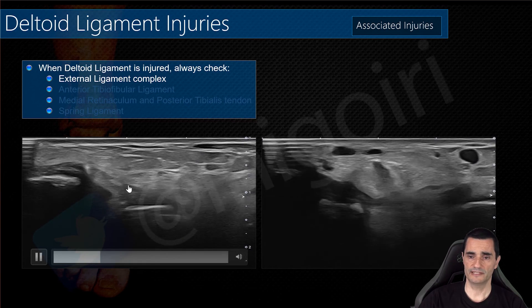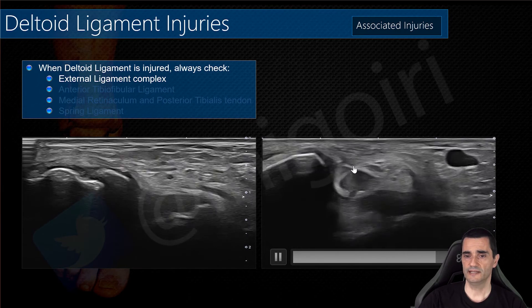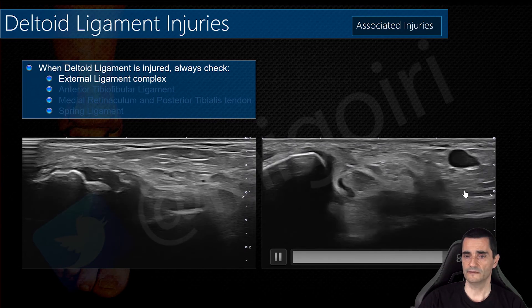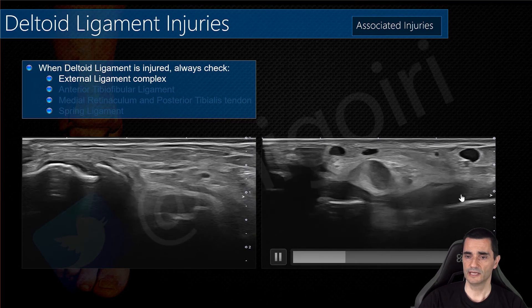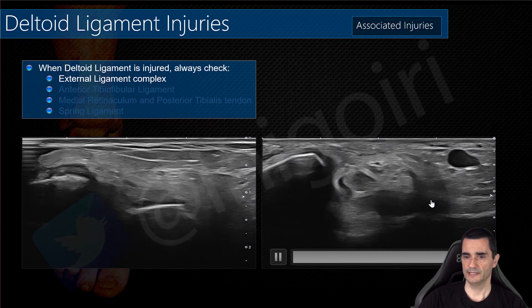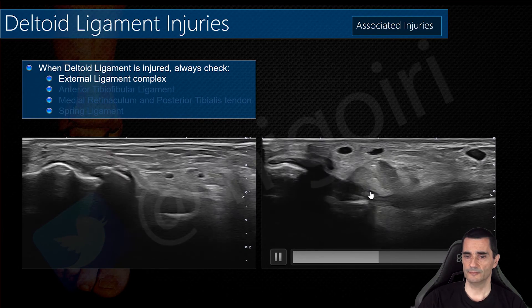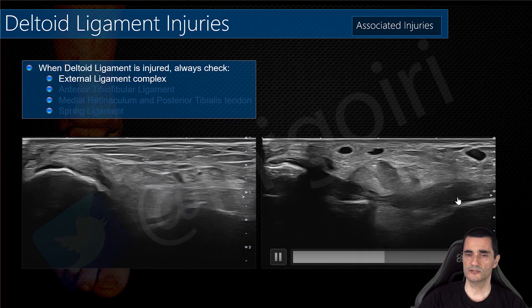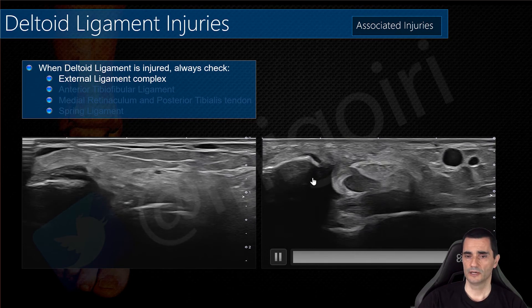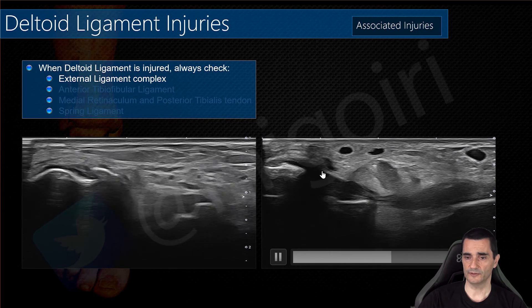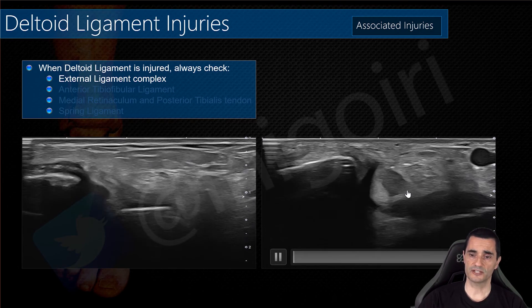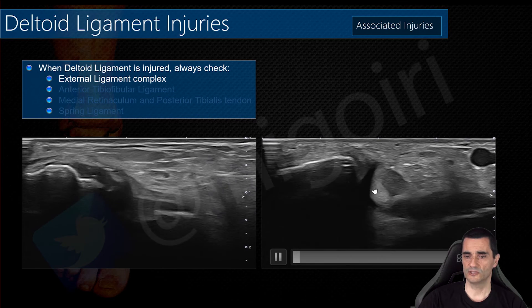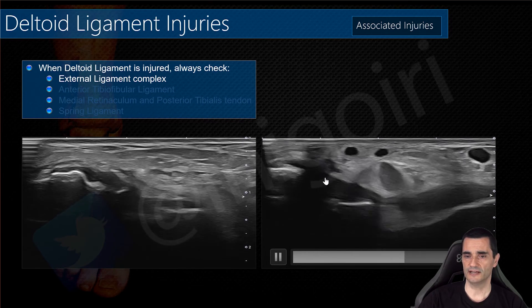In the same patient, checking the calcaneofibular ligament: you can see the peroneal tendons and below them the calcaneofibular ligament, which is thickened and hypoechoic — very thick in this area and thin here. However, there is always a small continuity with no total loss, so this is a grade 2 affection of the calcaneofibular ligament. With dynamic maneuvers in dorsiflexion, we notice some displacement of the peroneal tendons, confirming this is not a complete tear.